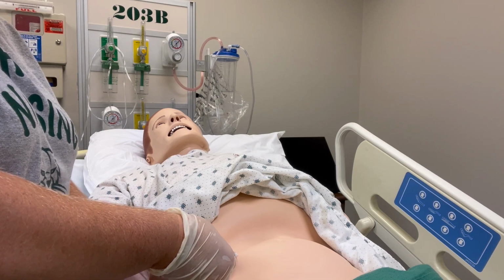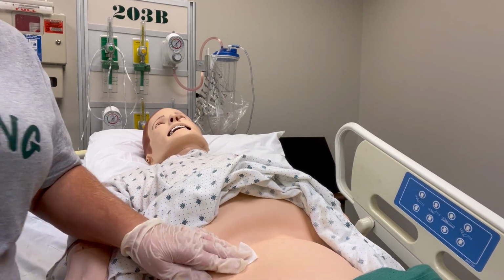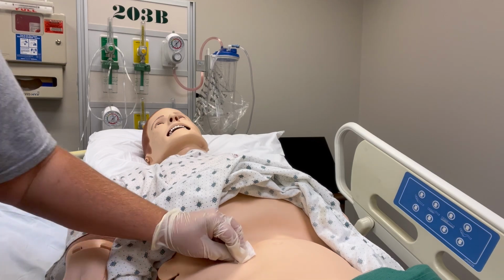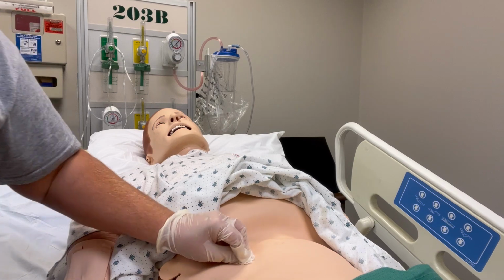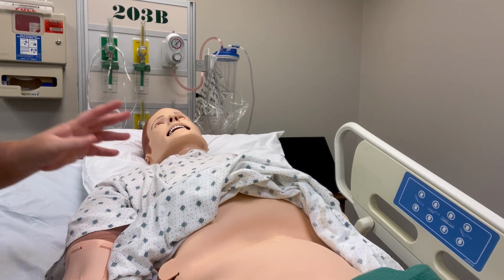And then carefully removing the needle, engaging the safety, and then I'm going to just blot if there's any blood or anything at that area. I'm going to make sure I put my safety cap engaged needle into the sharps. And then I'm just going to make sure that I document. I'm going to get Mr. Smith back in a nice comfortable position, get his bed down, make sure I get him anything he needs. And then I'm just going to keep monitoring that site to make sure he doesn't have any kind of reaction.